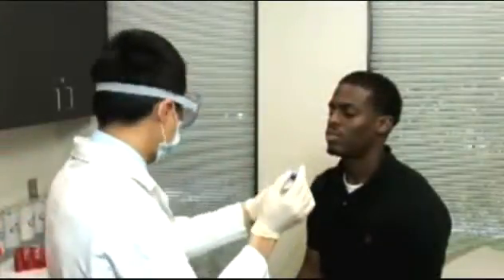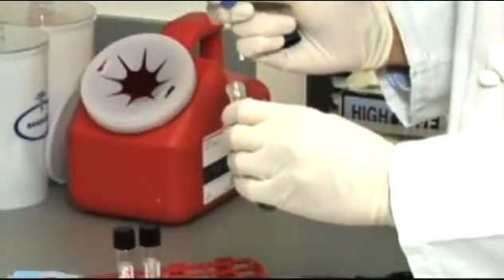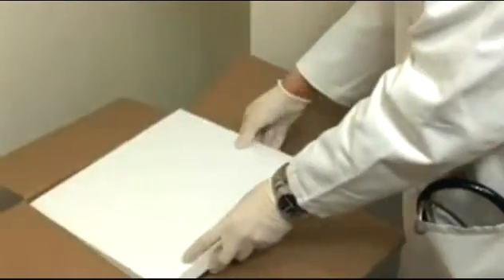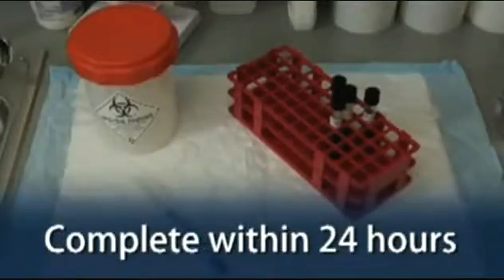If only one swab can be obtained, place it in the Regan-Lowe transport tube, which can be used for both culture and PCR. Store tubes at 4 degrees Celsius and transport to the lab within 24 hours of collection in a cooler with ice packs to maintain 4 degrees Celsius. Plating for culture will need to be completed within 24 hours of specimen collection, so timely transportation to the laboratory is essential.